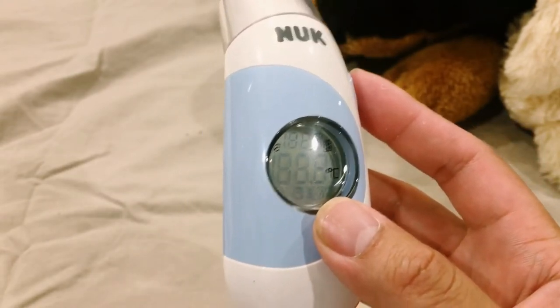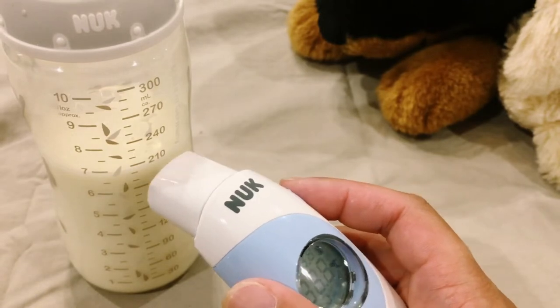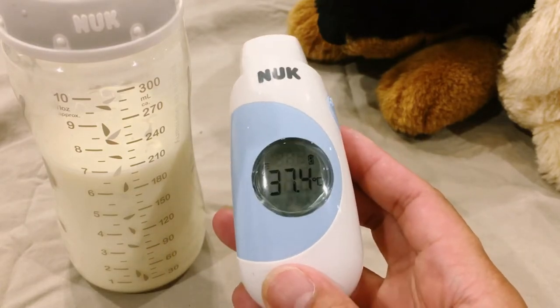You can use the thermometer in this mode to test the surface temperature of a bath or the temperature of a milk bottle. As you can see, the milk bottle is 37.4 degrees Celsius.